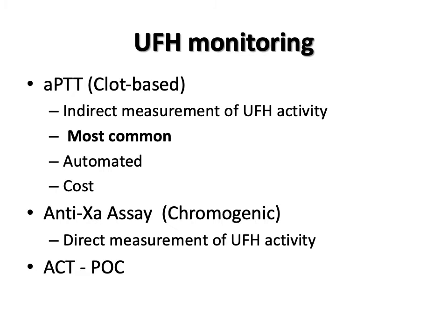If these are present, then patient monitoring should be switched to the anti-activated factor 10 assay. This assay enables the measurement of plasma heparin levels, both unfractionated heparin and low molecular weight heparin, and to monitor anticoagulant therapy. The ACT, or activated clotting time, is a point-of-care test performed using a whole blood sample, and was described in the last lesson. This point-of-care test can be performed at the bedside or during surgery.